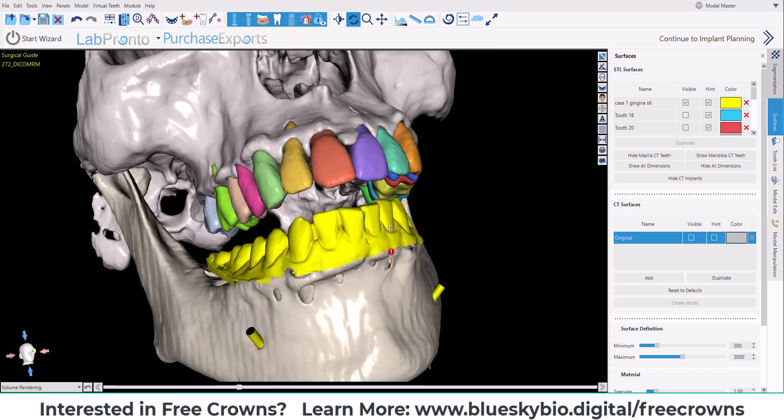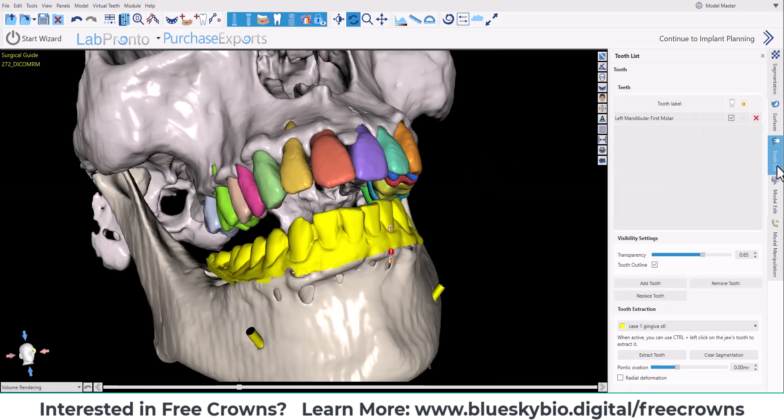Let's switch over to the tooth list. Here on the bottom, we've added a section called tooth extraction.